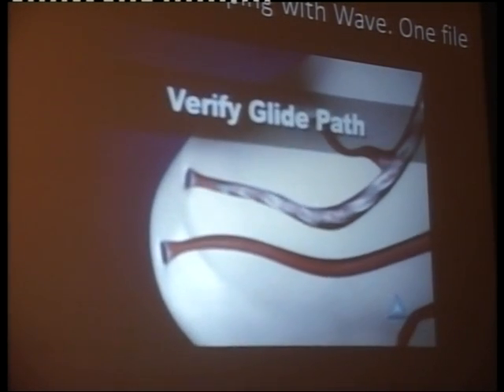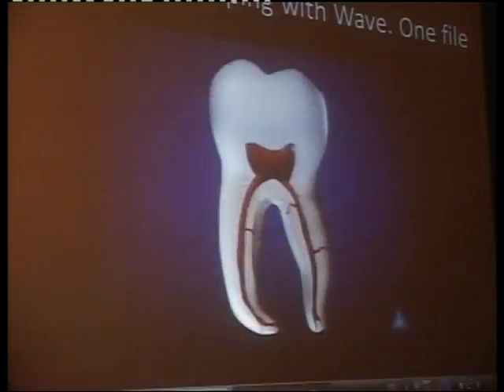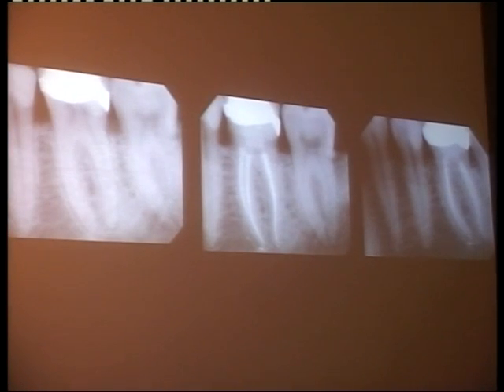Time is short, huh? Just a minute. This canal is prepared by the Wave 1. I am shortening it because another one is waiting. This canal is prepared with the Wave 1 system.